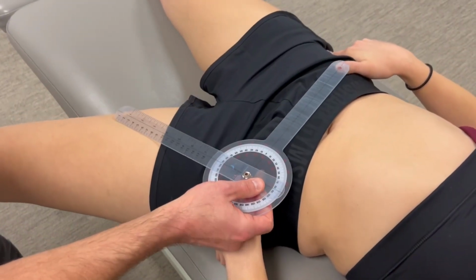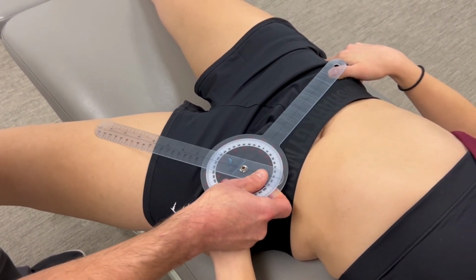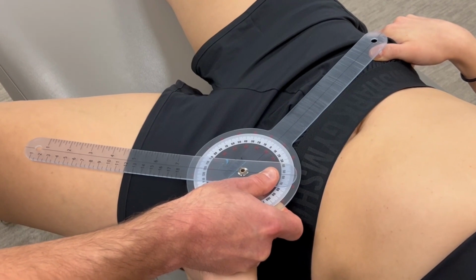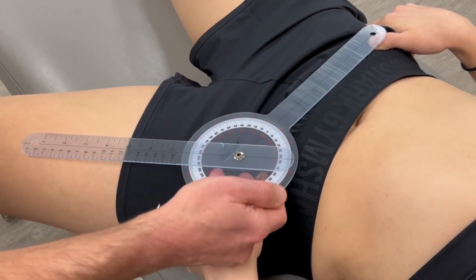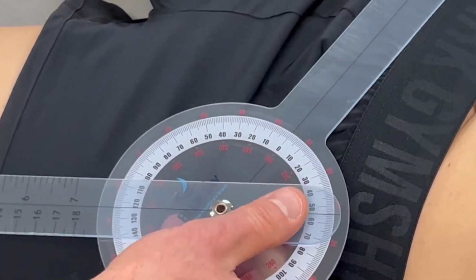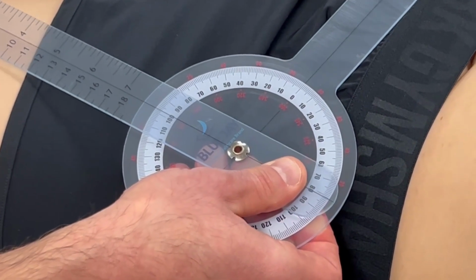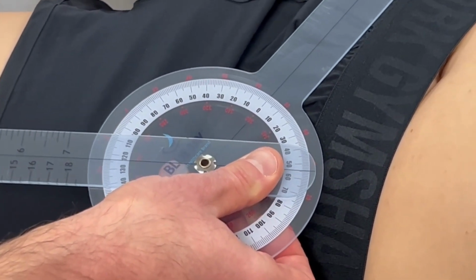So we're going to align the reference arm connecting those two ASIS, and then we're also going to align the indicator, or the distal arm, with the midline of the thigh. If you look at the goniometer here, we're going to use these red numbers since we started in this right angle or perpendicular position as we go into abduction. Hopefully you can see those red numbers. That's the scale we're going to be using.